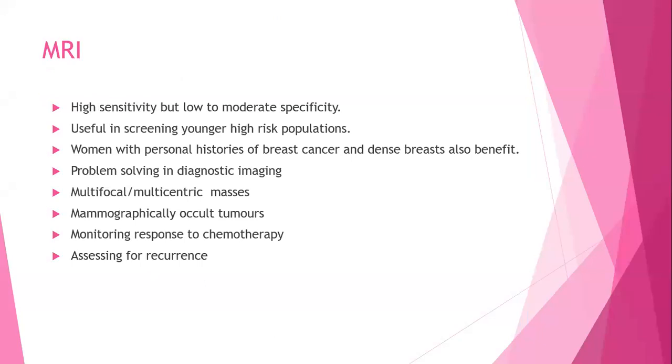One of the limitations of mammography is dense breasts, as I've talked about, with the effect of summation of tissues due to overlaps, or the effect of masking pathology, again due to overlap. So as much as DBT has attempted to address this to a large extent, you have breast densities which are extremely dense, such as the category D, where you may still have challenges even with digital breast tomosynthesis. In such patients, MRI would be the screening modality of choice.